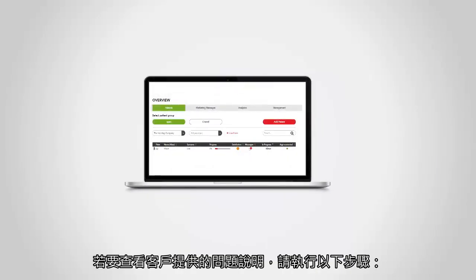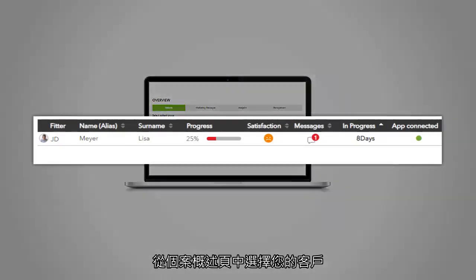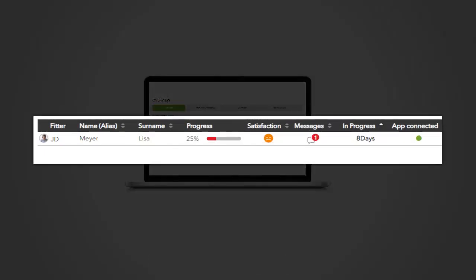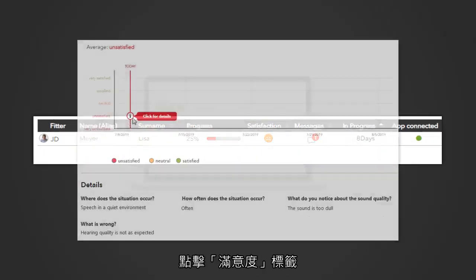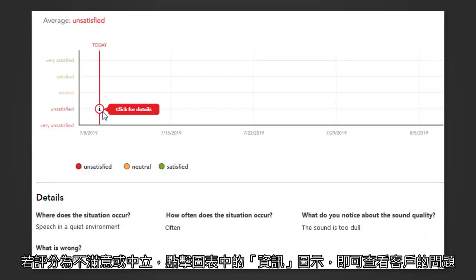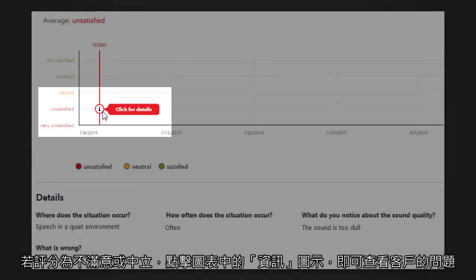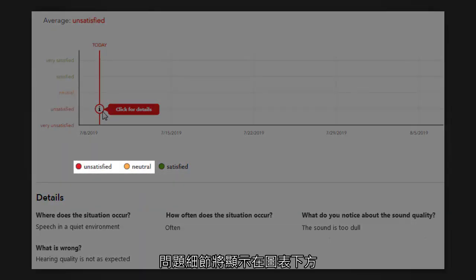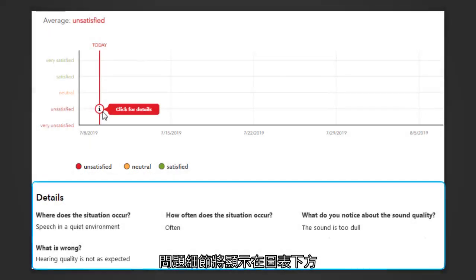To review the additional feedback provided by your client, please take the following steps. Select your client from the patient overview. Select Satisfaction in the tab overview. Choose the rating in the graph and click on the info icon to see your client's feedback in case the rating is unsatisfactory or neutral. This will be shown under the graph.